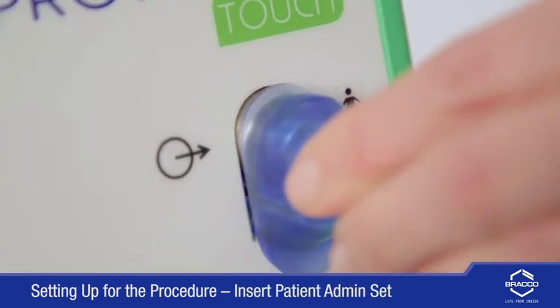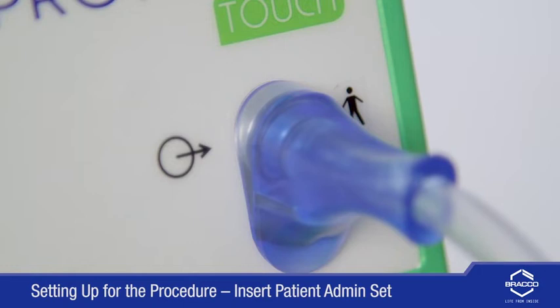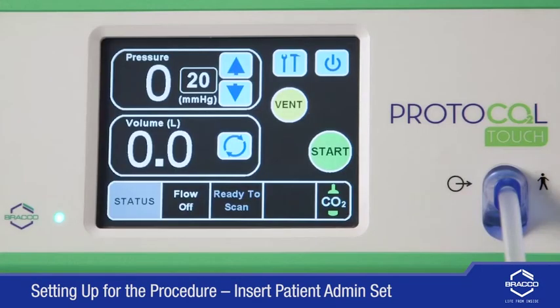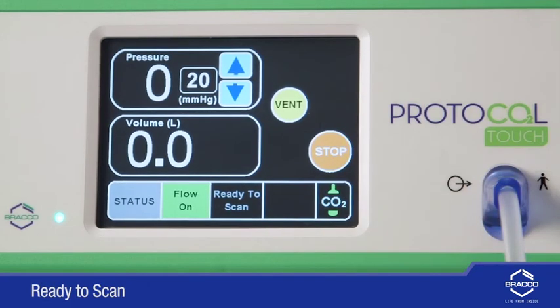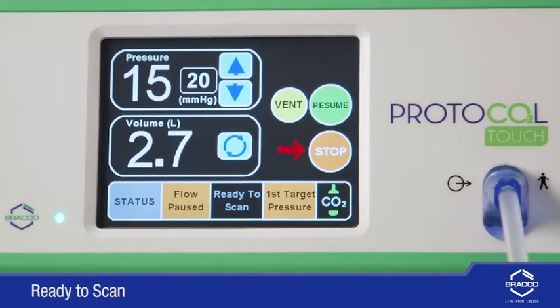Insert the Protocol Touch patient administration set into the device through a unique connector on the bottom right of the machine. With your settings saved, you are now ready to scan. Push the Start button to begin the flow of CO2 to initiate insufflation. If the unit has begun insufflation, the flow of CO2 may be paused by pressing the orange Stop button to allow time for the colon to relax. Once the patient is comfortable, the flow can be restarted by pressing the green Resume button.